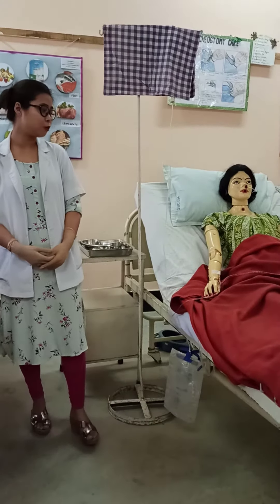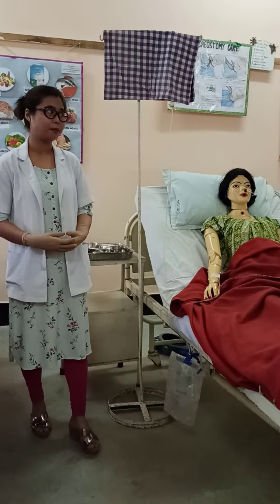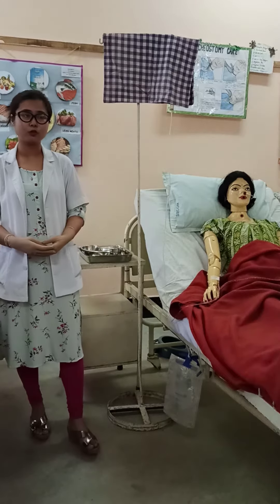Hello everyone. I am going to show how to administer blood transfusion.